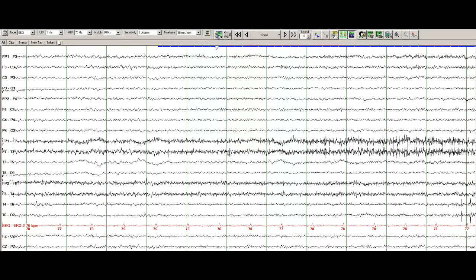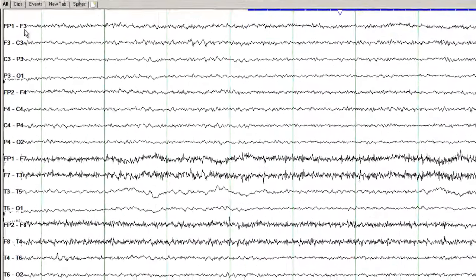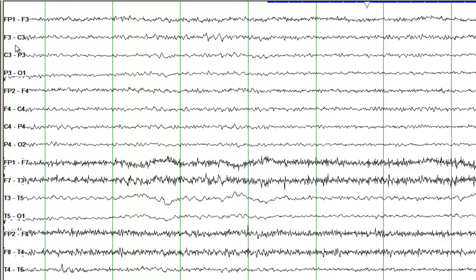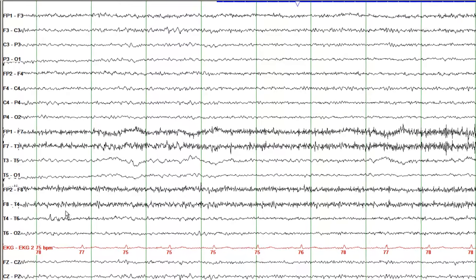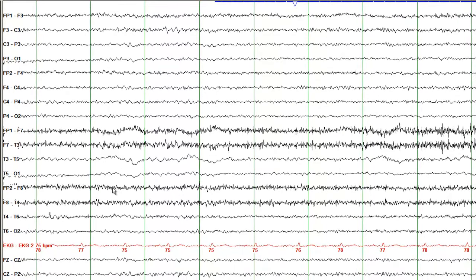So that was a basic introduction of the different tools available on the software. For the labeling of the electrodes: odd numbers are recording from the left side, even numbers from the right side. FP is frontopolar — so it is recording from the frontopolar area, and since it ends with an odd number, this is the left frontopolar area. T is temporal, O is occipital — so that gives you an idea of where the EEG activity is being recorded from.